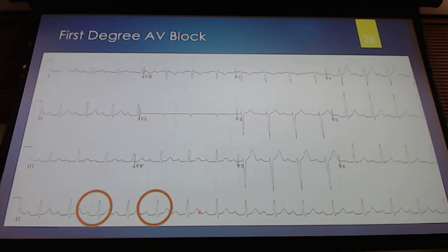Sometimes these patients have such a prolonged PR interval, the P is actually embedded into the T. It's actually embedded. So then you're trying to look for that P. You're like, why is my P not next to my QRS? What is this thing over here? And that's actually your P that's way over there because of the degree of the prolongation of that PR interval.